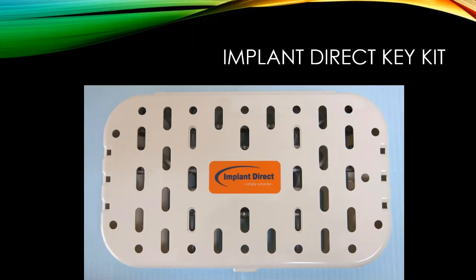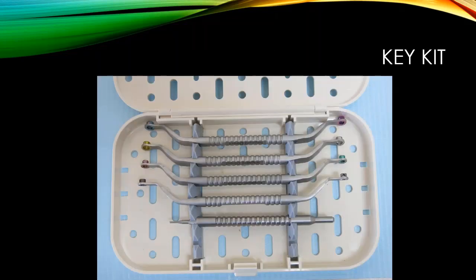Now that we have a guide, now we can move into the surgery. The first thing that we'll show here is the Implant Direct Key Kit for the guided surgery. And so what a key kit is, is a series of instruments which fit into the guide, which allows the drills to step through incrementally to create the final osteotomy.